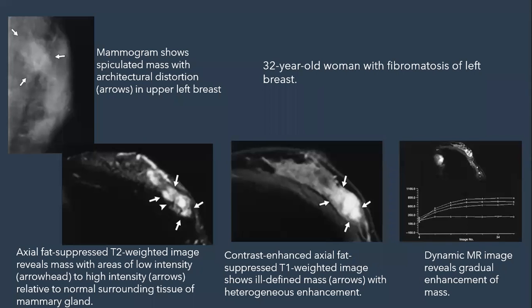Yes, she has rare fibromatosis. What is fibromatosis associated with in the breast? The condition itself is rare and the association is rare. What would you like to ask me about? Does the patient have what?